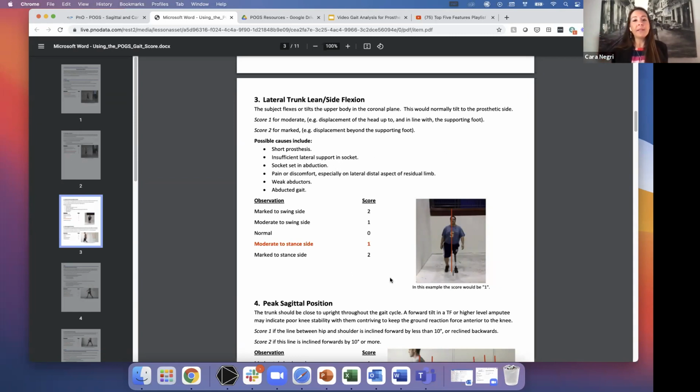So I really like to keep these notes open while you're first starting to use these scores. Now, keep in mind, of course, as I'm explaining this is going to take me a lot longer than it would take me on a normal basis. But I would say that when I started with these scores, it would take me about 30 minutes to do one initially, but now I'm down to maybe even 10 minutes.